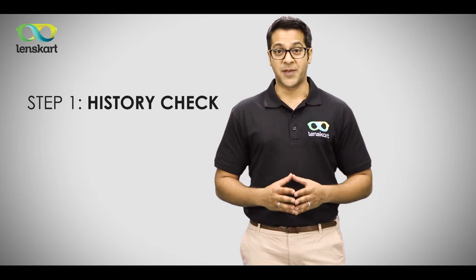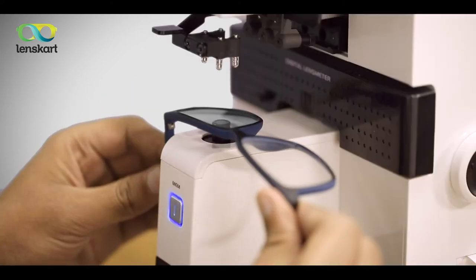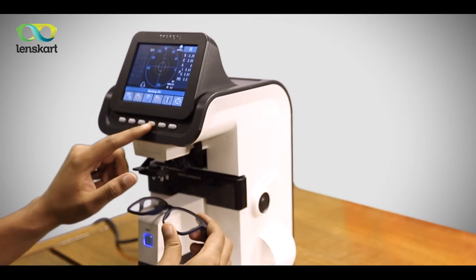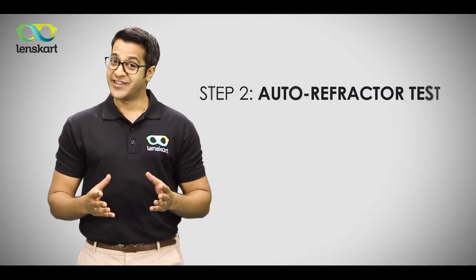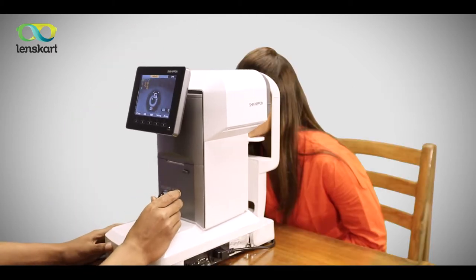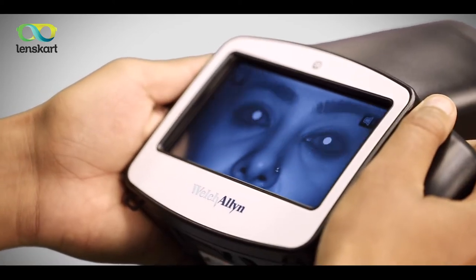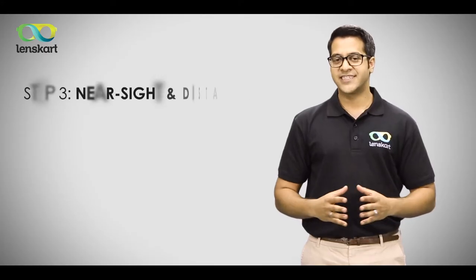Step one: if you're already wearing spectacles, we'll check their power using a Japanese lens-o-meter. Step two: we will then examine your eyes using an auto refractor. Our auto refractors are from the best companies across the globe, and we will carry either one of them to examine your eyes.